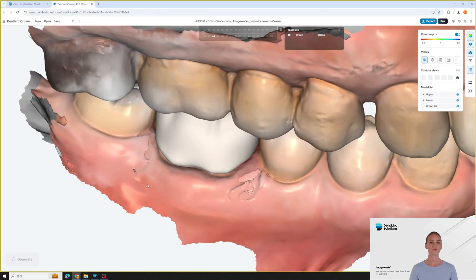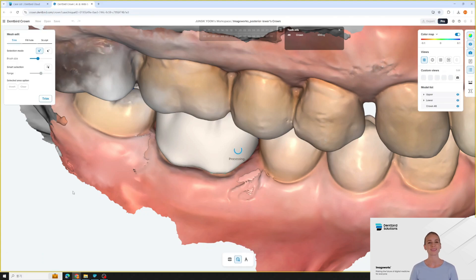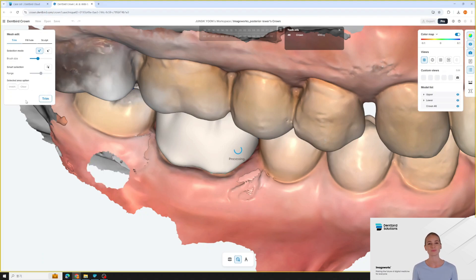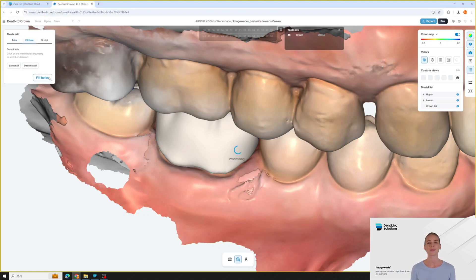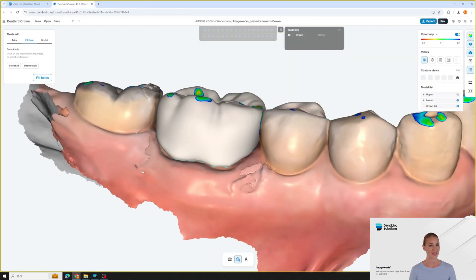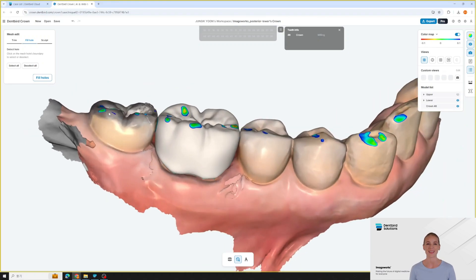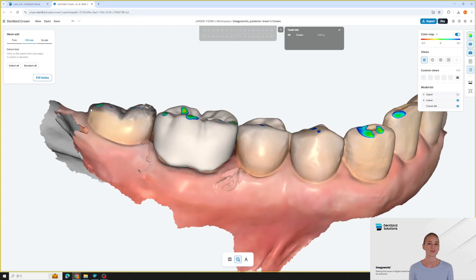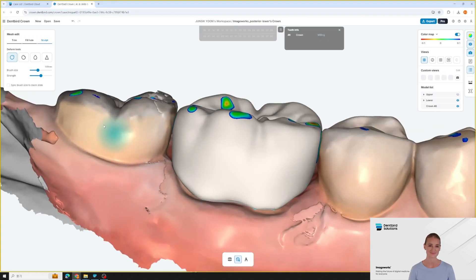DentBird provides a range of powerful pre-processing tools in case your scan data needs some cleaning up before moving on to the design phase. Here you can trim unnecessary parts, and use fill hole for any holes. DentBird automatically analyzes the surrounding mesh data and seamlessly integrates the missing areas, ensuring natural contours and anatomical accuracy. There's also sculpt. This marks the end of the pre-processing stage.